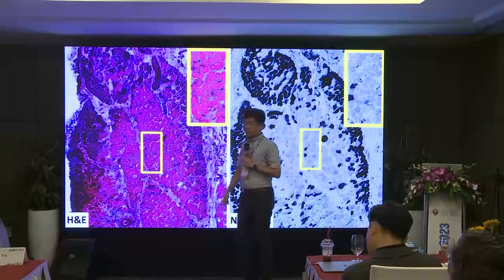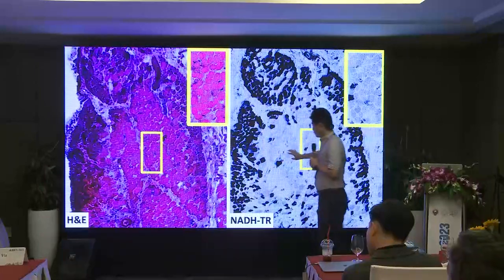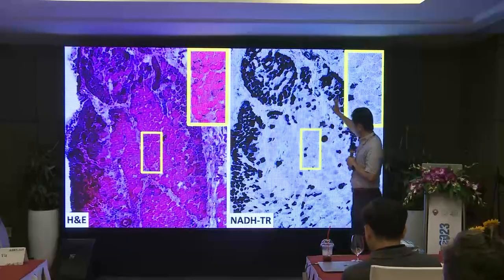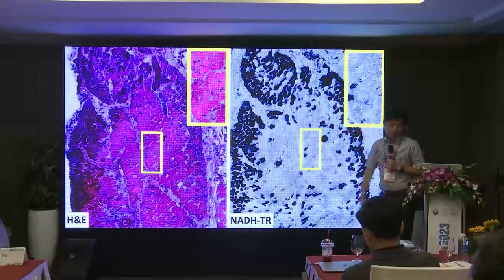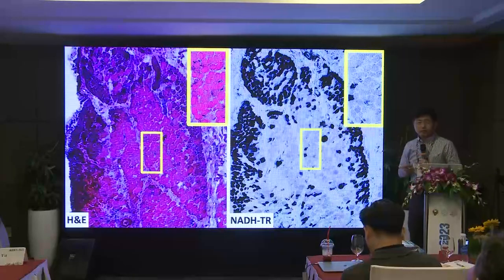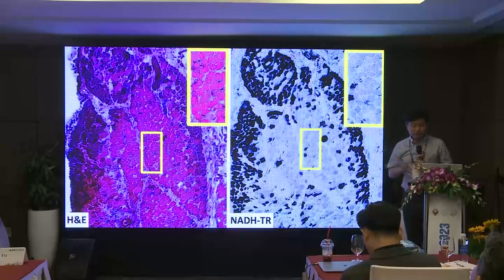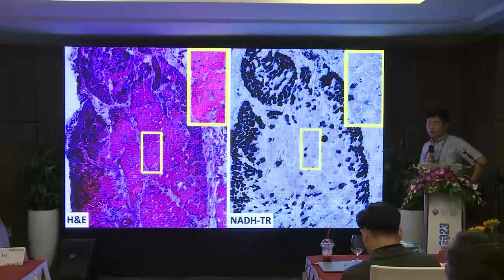Another form of necrosis: the whole area of muscle fibers is necrotic, and on NADH staining all activity is lost. They are all necrotic fibers but without macrophage invasion. This whole-area necrosis is believed to reflect micro-infarction of the muscle, and this is sometimes seen in dermatomyositis patients.